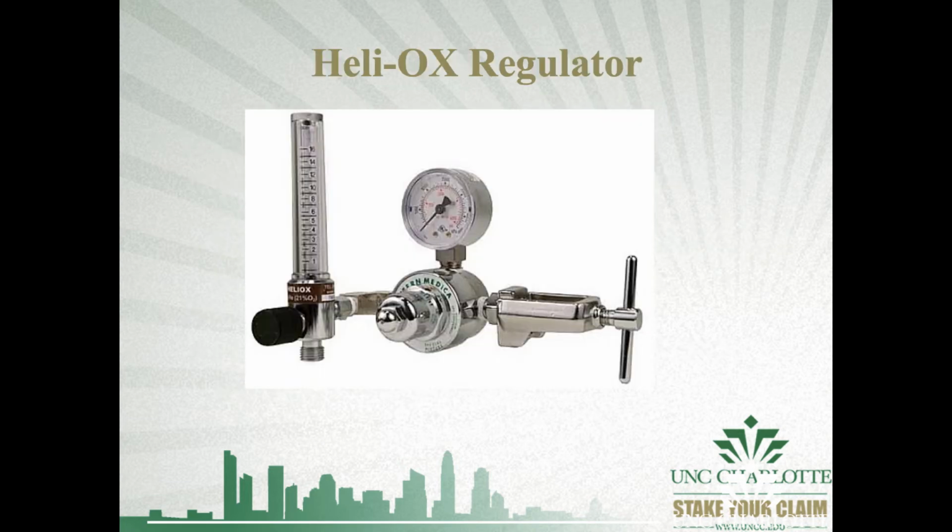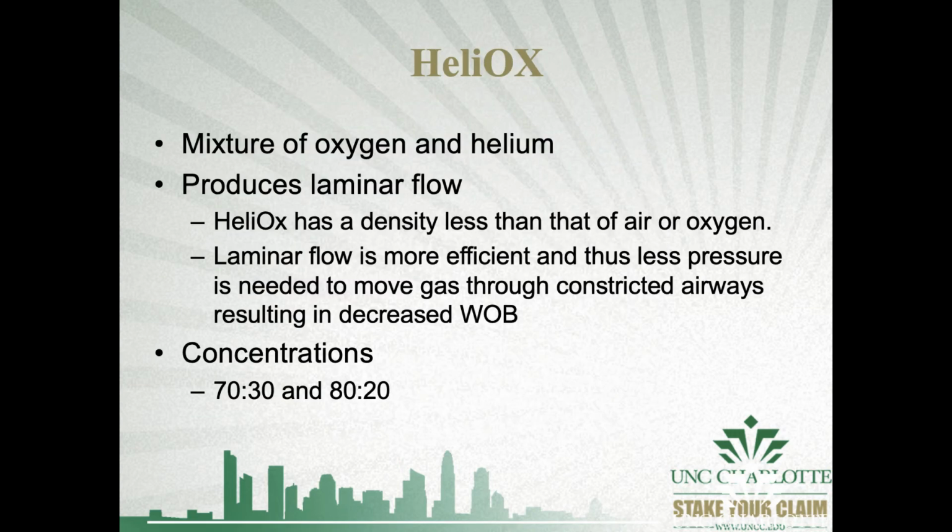We're going to cover Heliox and nitric oxide really quickly. This is an adult targeted course, so I don't know how often you guys are using Heliox with adults. I've used it quite a bit in the MICU for my asthmatics, but they probably should have gone on ECMO, to be honest with you. But I've used Heliox to good effect. Heliox is a less dense gas than our normal ambient air or oxygen by itself, and it is supplied in concentrations of 70-30 or 80-20.